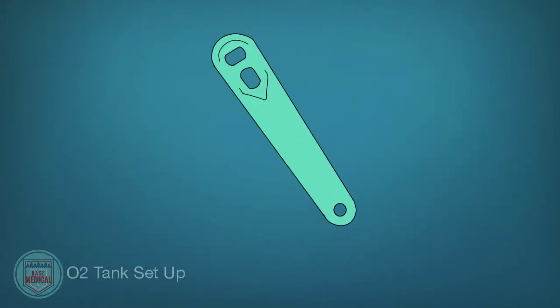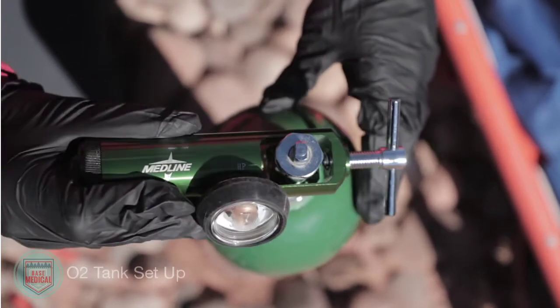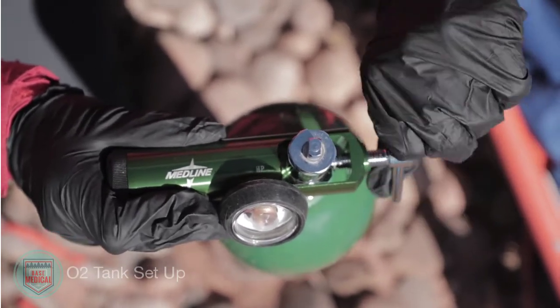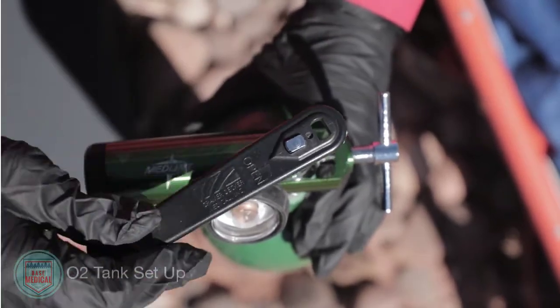The oxygen key is used to open or close the oxygen tank. It is strongly recommended to keep this key attached to the bottle or in your pocket. Some tanks come with a lever, making a key unnecessary. First, turn the valve opening away from you and use the oxygen key to crack the tank to rid any debris from the valve — a quick open and close. Next, attach the regulator with the O-ring in place by lining up the pins and hand-tightening. Then use the oxygen key to fully open the tank and check the pressure. If less than 200 PSI, do not use it.